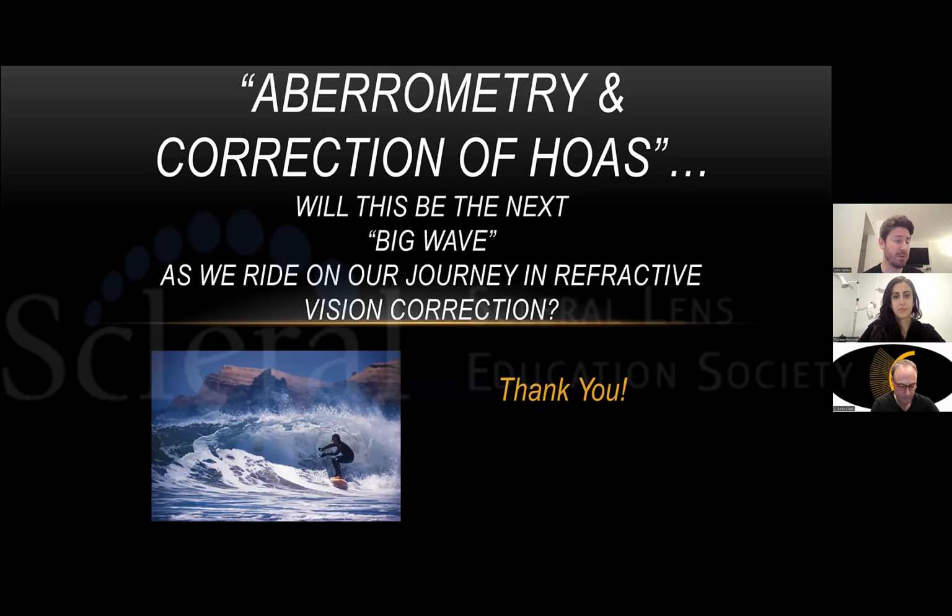Or move to something else that'll center better. In general, in scleral lens fitting, what I run into is that if you don't have a stable platform, you're not going to get stable optics, and that's extraordinarily important in wavefront guided lens fitting.